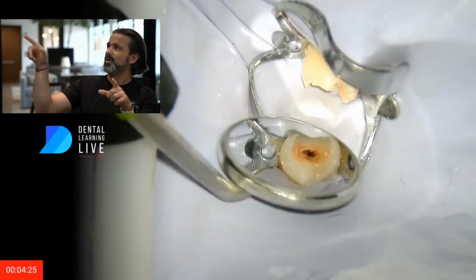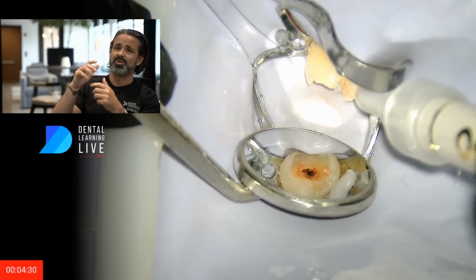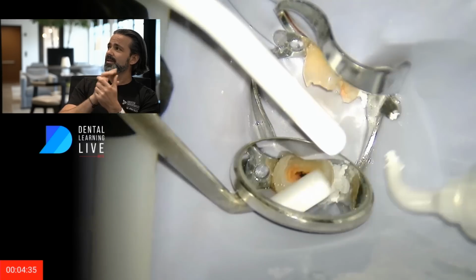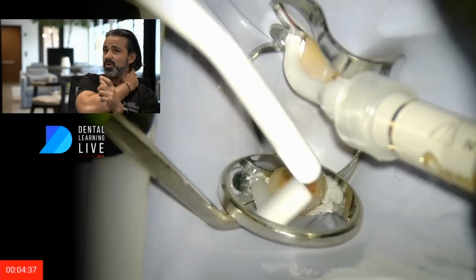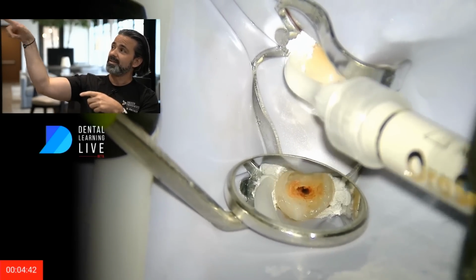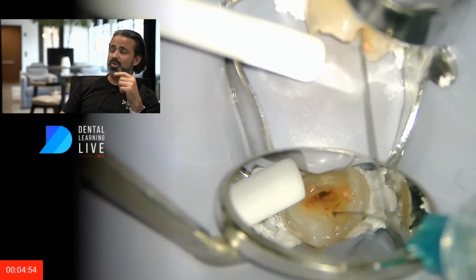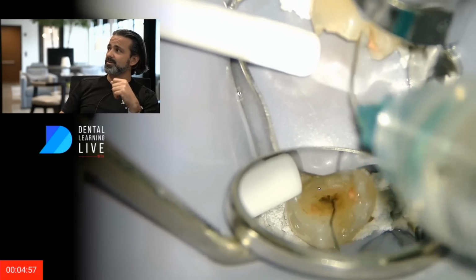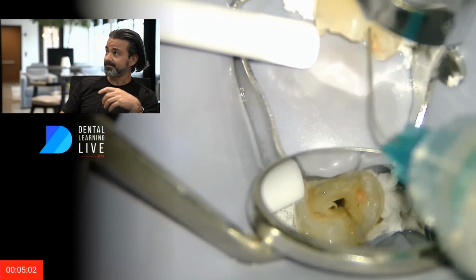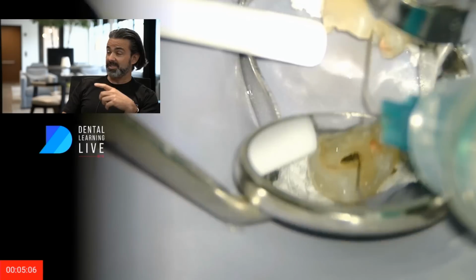Now, when you use a double bowed clamp like that, I find myself using 25 millimeter rotary files so my handpiece isn't pushing on that bow. Since I can feel that bow rocking a little bit, I'm going to put some caulking around it because I don't want any fluid to come through, or bleeding or whatnot. So I'm now going to add some hypochlorite in my discovery phase. I'm just going to instrument in a solution of sodium hypochlorite. And again, I'm using that tip trying to find where that bifurcation is. I'm feeling something down there.